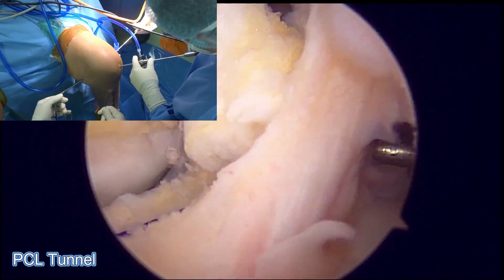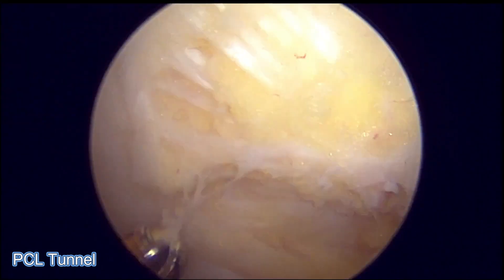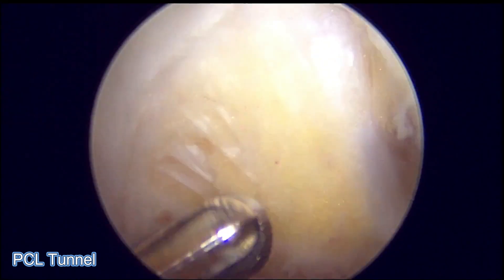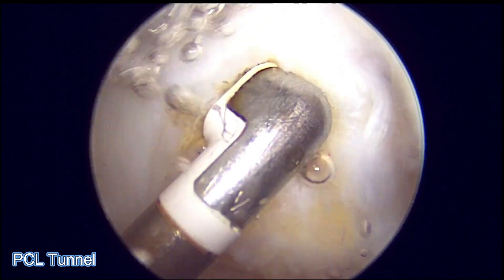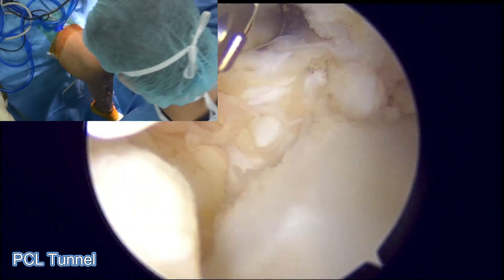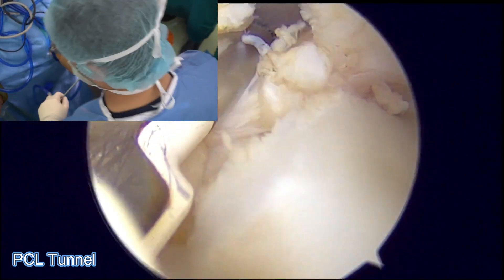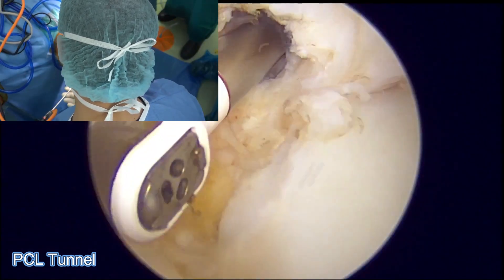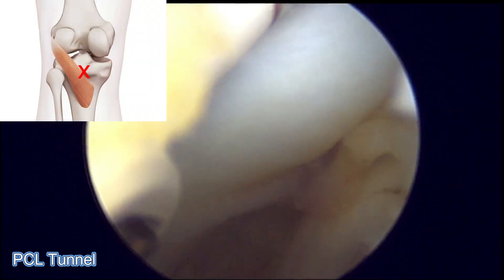To create the PCL tunnels, we first move back to the anterior portals. The PCL remnant is identified and the tunnel is marked at the center close to the cartilage. We go back to the posterolateral portal to visualize the location of the tibial tunnel just above the popliteus muscle belly.